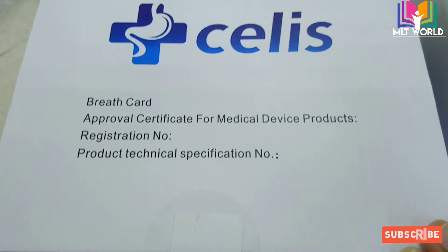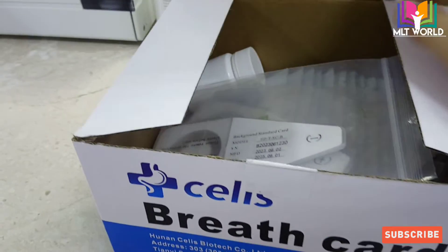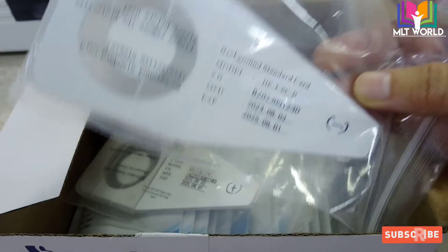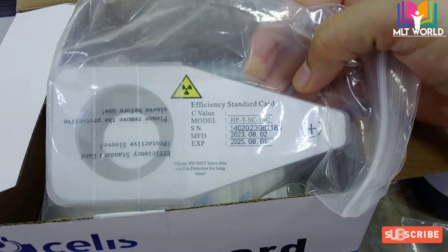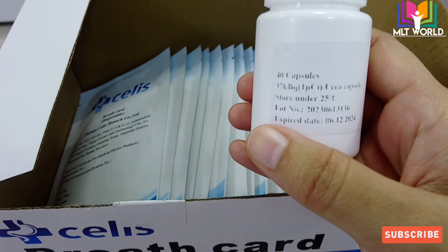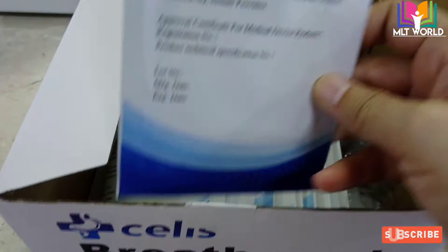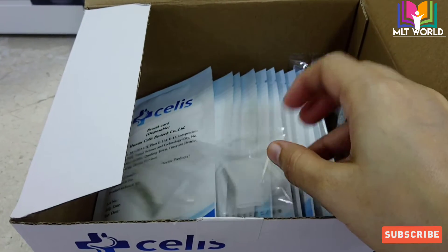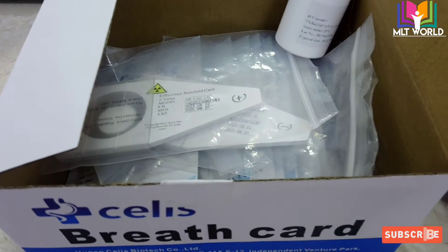This is the kit that comes with the machine. There are two controls — negative and positive controls. The kit is also from the same company, Salis, called the breath card. The negative control has a very long expiry and we can use it on a daily basis. One will show negative and one will show positive. The controls are supplied by the supplier of the machine, not with each kit. This kit contains 40 capsules and 40 cards. In part two of the video I will show how to prepare the patient for this test.